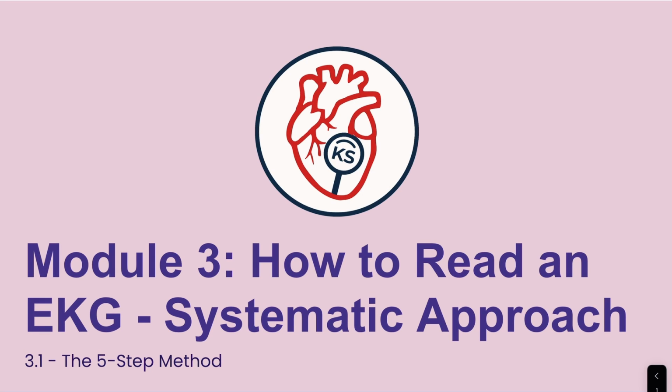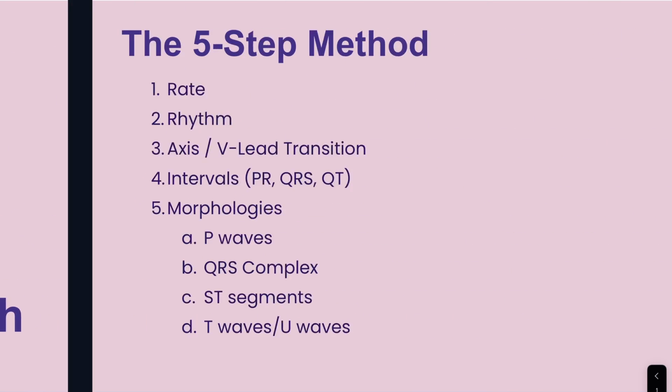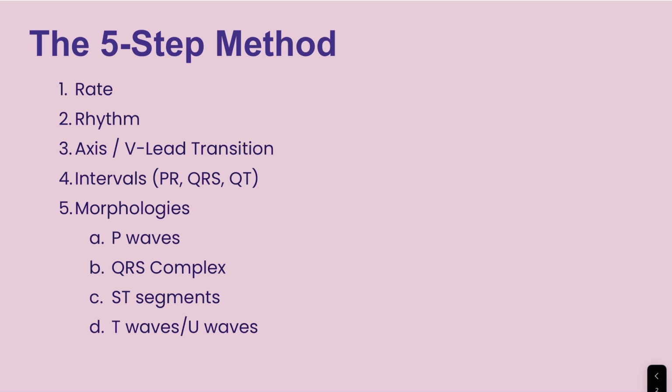Welcome to Module 3, How to Read an EKG, Systematic Approach. Let's get started. I want to start off with a little bit of a disclaimer here. By no means am I trying to say that there is only one method to analyze an EKG. This is the method that I was trained in. However, if there is a method that you know that works for you, please stick to that.